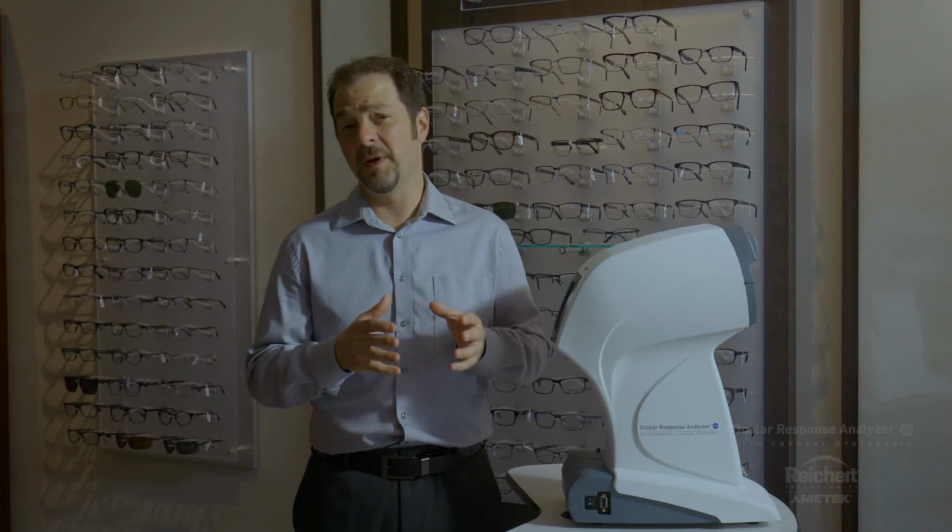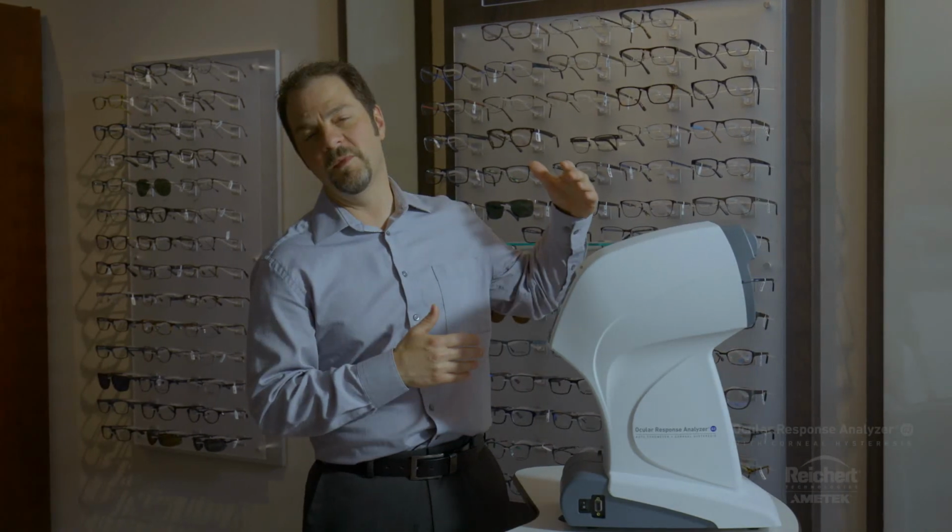So, if you're seeing differences between IOP-G and Goldmann tonometry in some patients, even if it's a large disagreement on occasion, that should be considered normal. If you're seeing an offset, for example, if your Goldmann's always 4 millimeters higher than the IOP-G or 4 millimeters lower than the IOP-G, and it's happening in the vast majority of your patients, well, that's unusual.